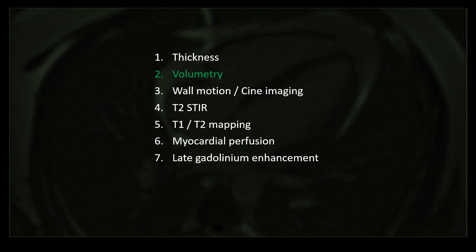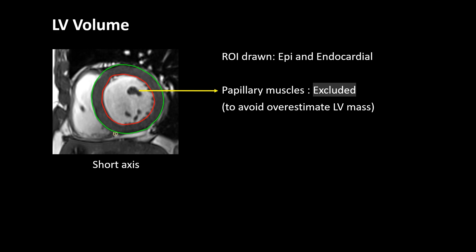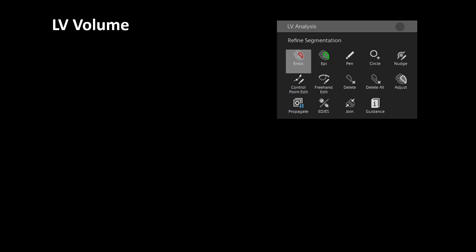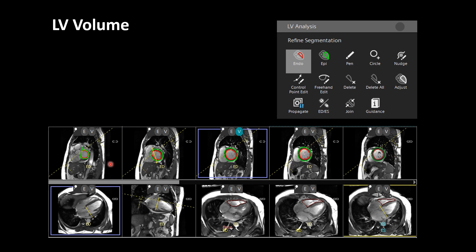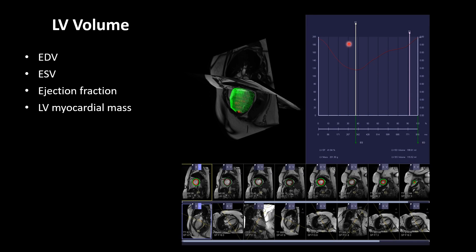Now coming to volumetrics. For this we need to draw ROI, or region of interest, over the endocardial and epicardial surface of the LV wall. The papillary muscles should be excluded to avoid overestimation of the LV mass. You draw ROIs on each segment, and if you are using SINGO, these are the tools used to draw the ROIs. Then you get a graph which gives you the end diastolic volume, end systolic volume, ejection fraction, and myocardial mass.